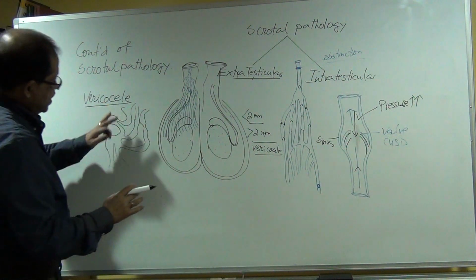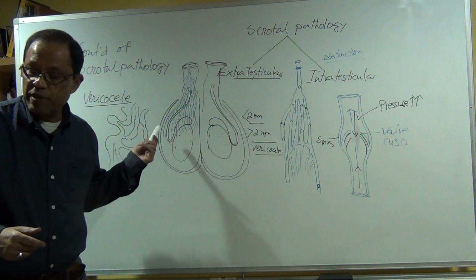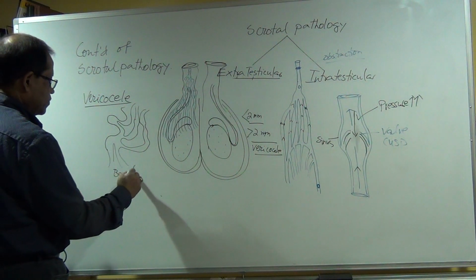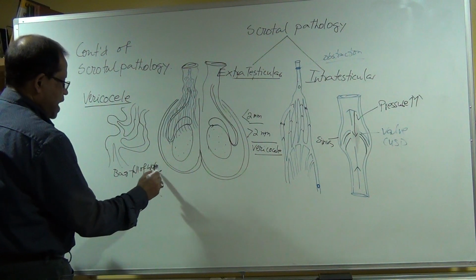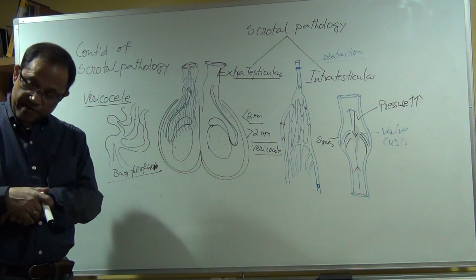When it is dilated and looks like that, it feels like a bag full of worms. A bag full of worm fillings. That is varicocele.